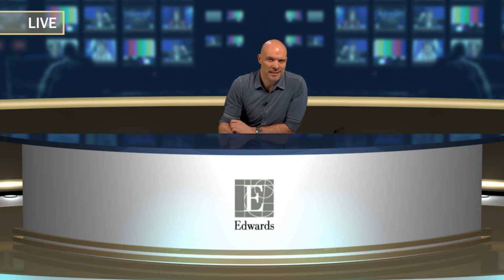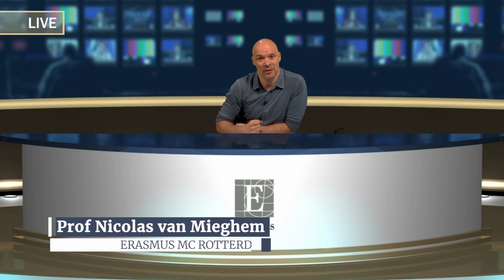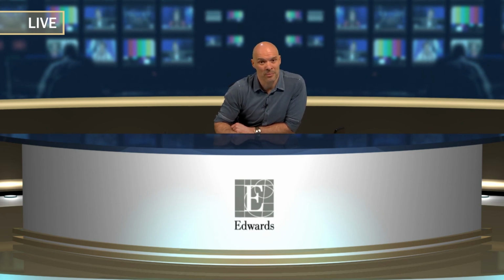So we've covered a lot in these last 90 minutes, focusing on Edwards Lifesciences and their technology to treat functional tricuspid and mitral regurgitation. I think PASCAL is a technology that is here to stay. We see already the new device iterations that make a difference. We've also seen a glimpse into the future with this impressive presentation of the EVOQUE system. I think there is a lot of potential, and I think the future looks bright for patients with functional MR or TR.